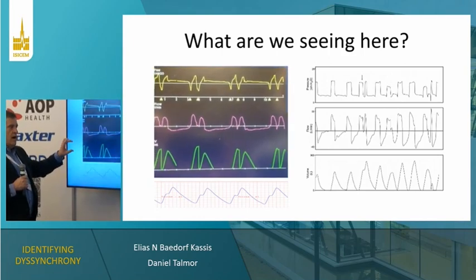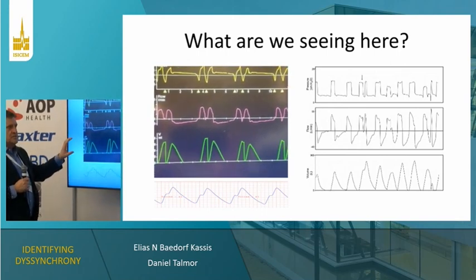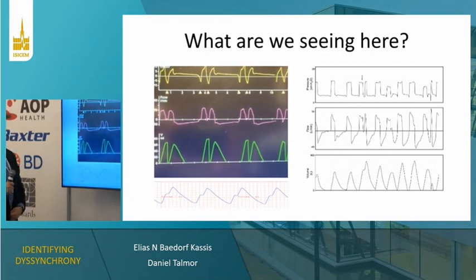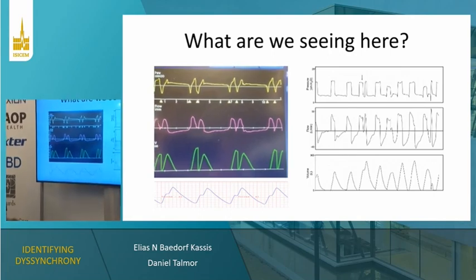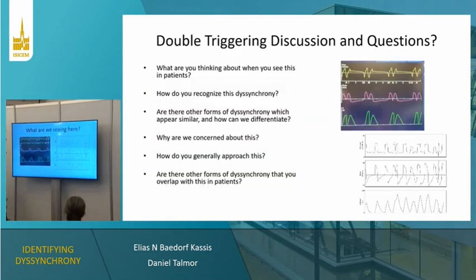And you know why the ventilators do that, I'm sure there's a good reason, but it can be extremely misleading in this form. Yeah, so those waveforms are from just integrating the flow. And by integrating the flow, you're able to see the total volume that's delivered through that complete breath stacking event.